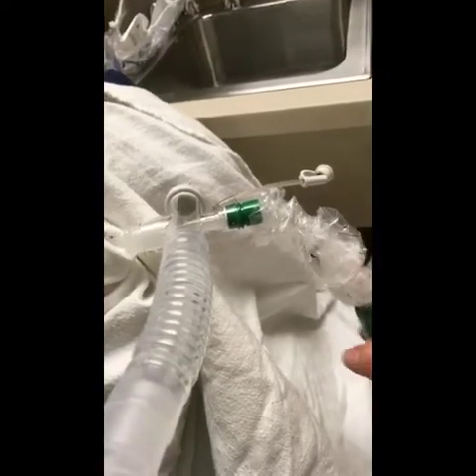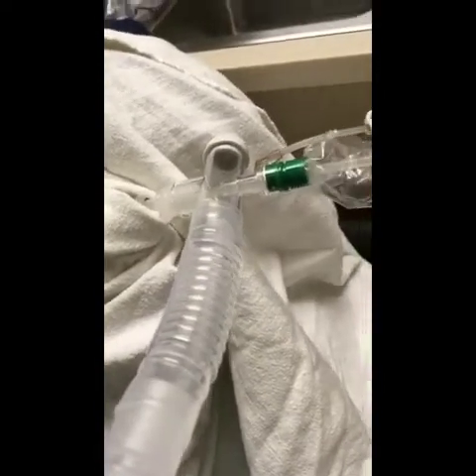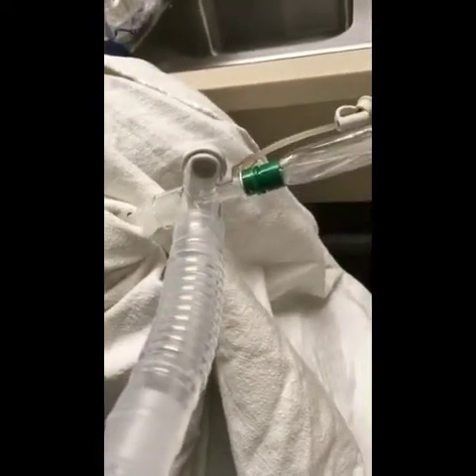Come back to room 223. The vent has not stopped alarming. Oh, here's the problem. The catheter got left in the circuit. Just gotta pull it out.